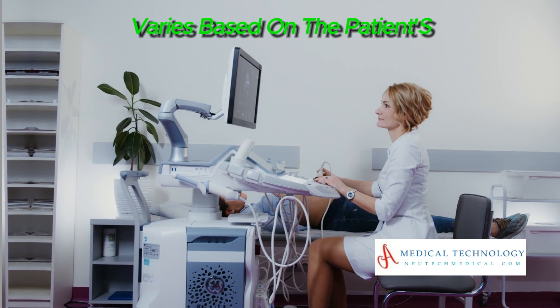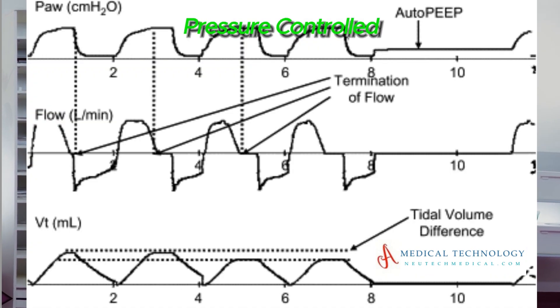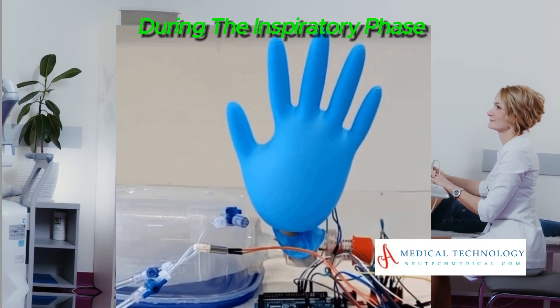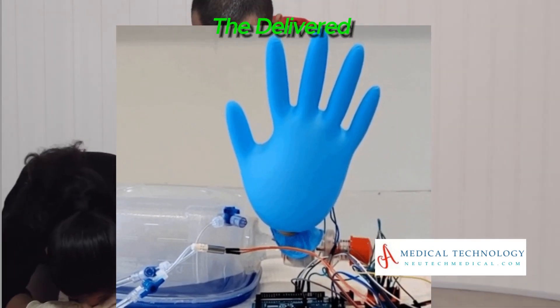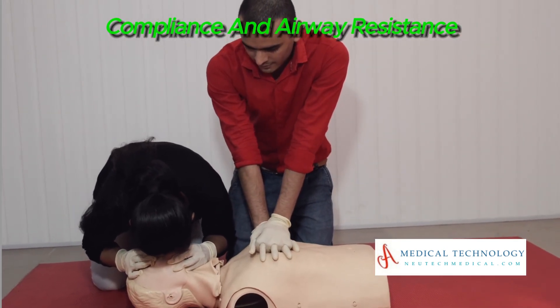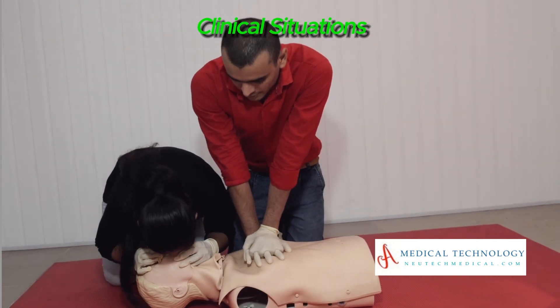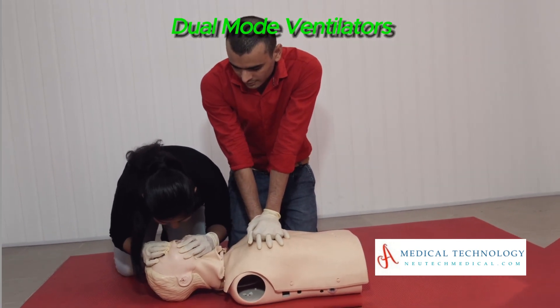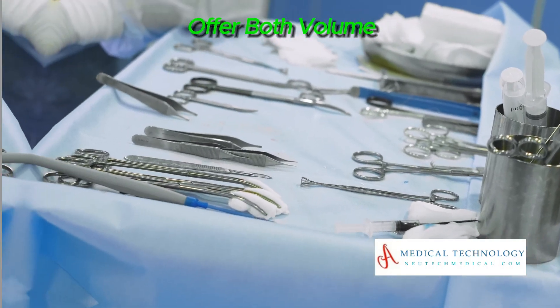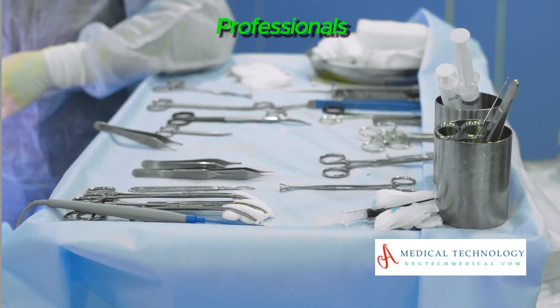Pressure controlled ventilators maintain a constant pressure during the inspiratory phase. The delivered tidal volume depends on the lung compliance and airway resistance. These ventilators are often used in specific clinical situations. Dual mode ventilators offer both volume controlled and pressure controlled modes, allowing healthcare professionals to choose the most suitable mode based on the patient's condition and requirements.